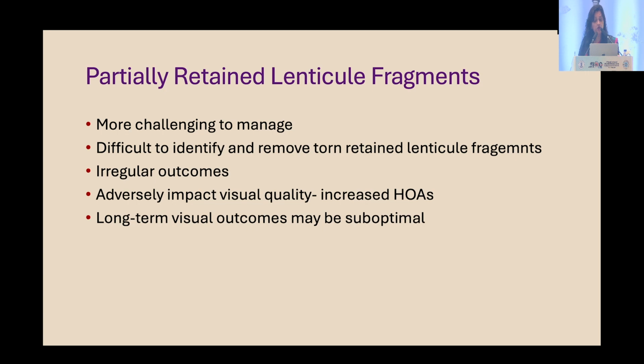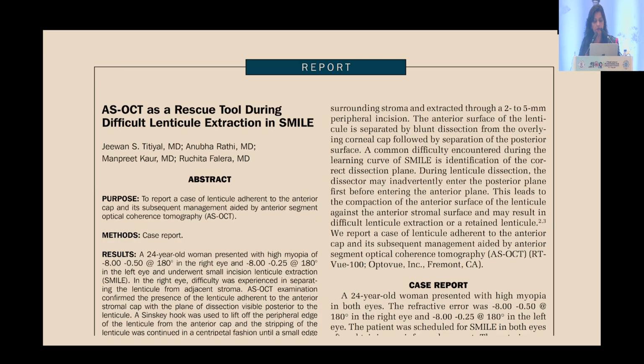Partially retained lenticule fragments do lead to irregular outcomes and can impact the visual acuity, and there may be increased higher order aberrations subsequently, and the long-term visual outcomes may be suboptimal.